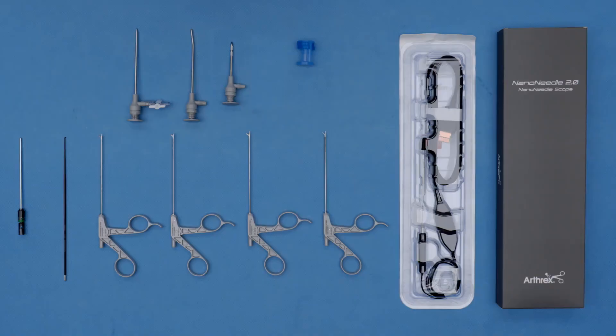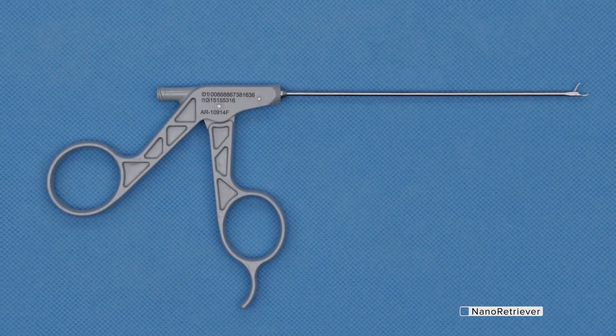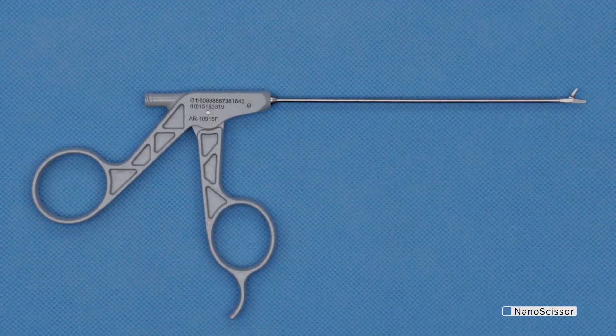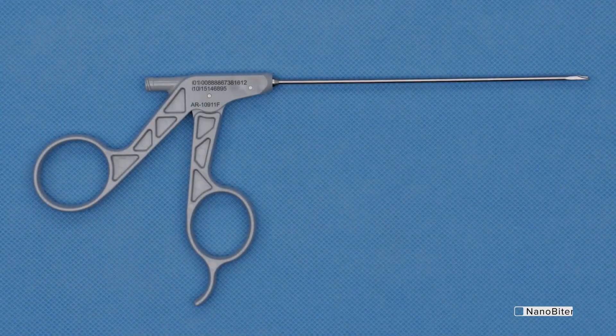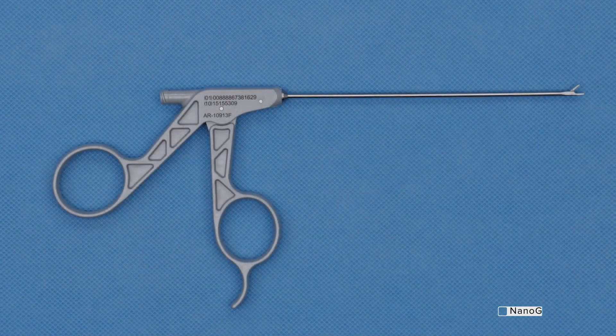Starting with the back table, working from right to left: the Nano Needle 2.0 scope. It comes in a single-use peel pack, exactly the same as the Nano Needle 1.0. It has the same handle, the same plug, and white balances the same way. The difference is just that the box is gray. We've got the Nano Suture Retriever, the Nano Scissor, Nano Biter, and then the Nano Grasper.